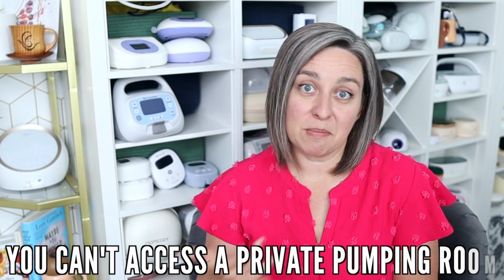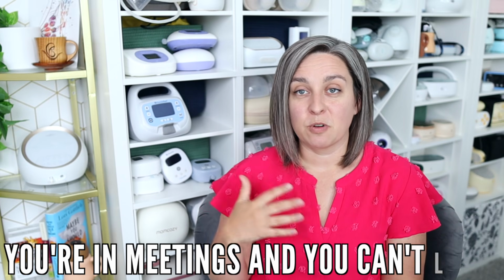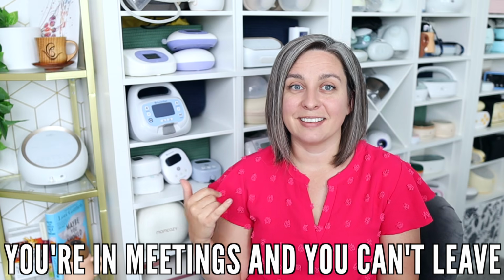Like I said, I help clients use wearable pumps often, and there are several situations where the benefits might outweigh the downsides. Wearable pumps excel when you can't access a private pumping room, all right? Or you need a more discreet pumping option. Or when you're in meetings or procedures that you can't leave.